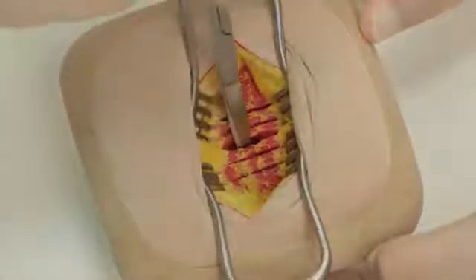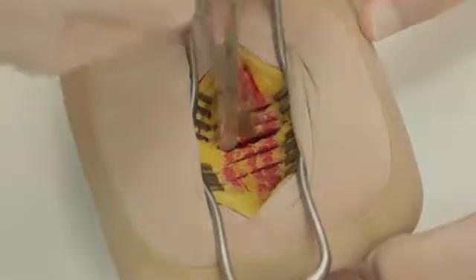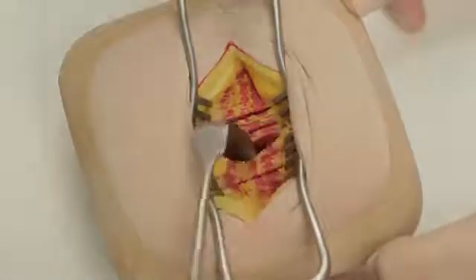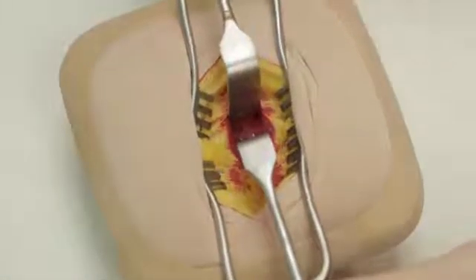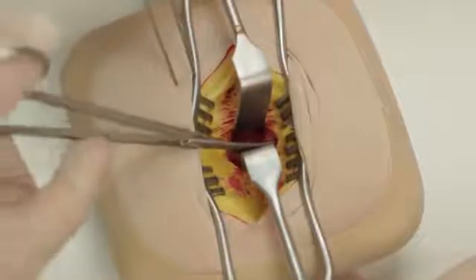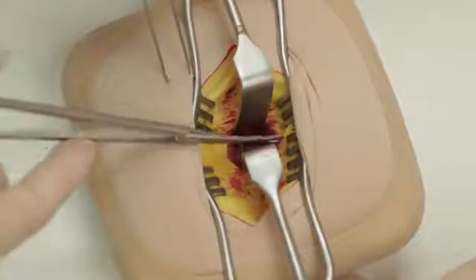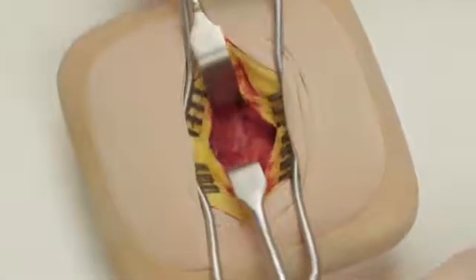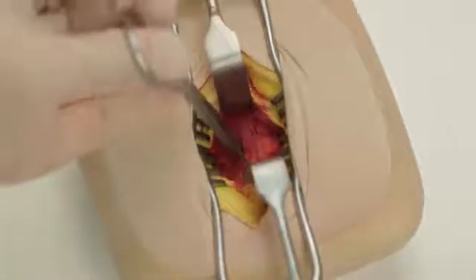Internal oblique should be split rather than divided by opening Mayo's straight scissors in the line of its fibres. The split can be widened using Langenbeck retractors to display the muscle underneath. Transversus abdominis should also be split in the line of its fibres.